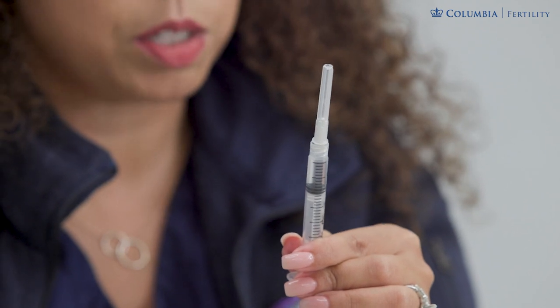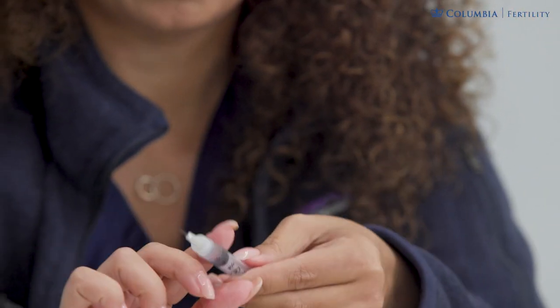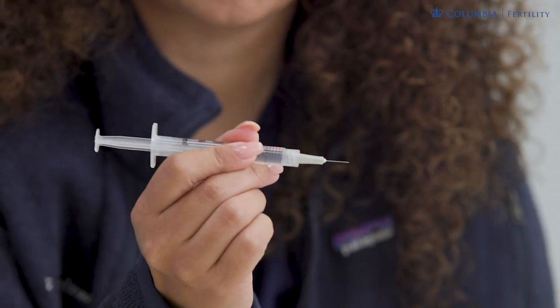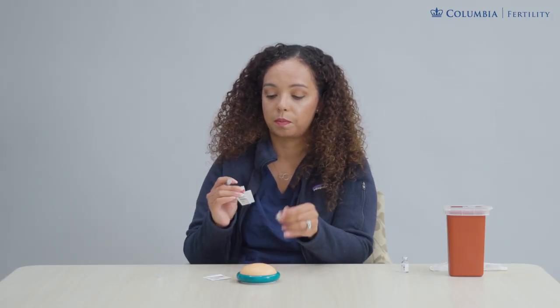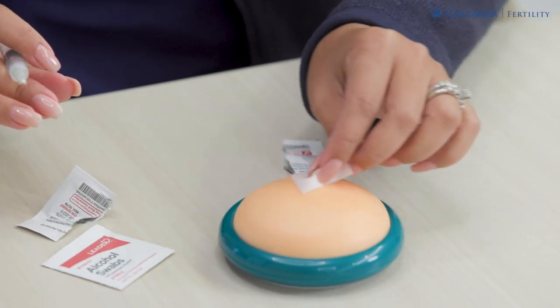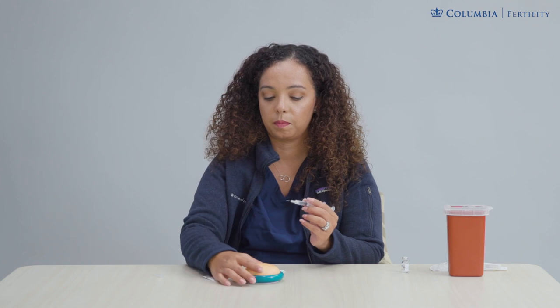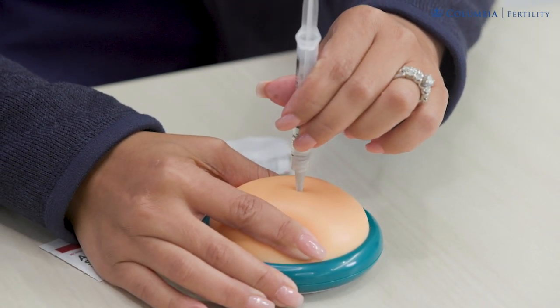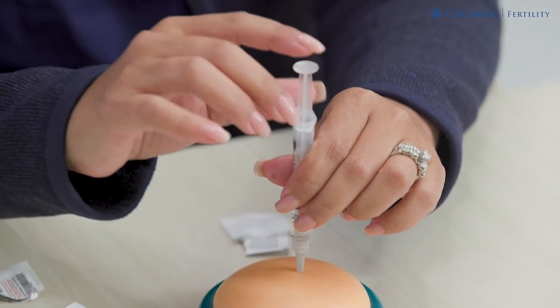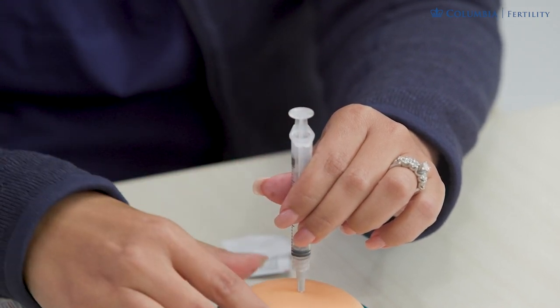Once you have completed those steps, you are ready to inject. First, remove the cap on the needle and hold your syringe like a pen. Do not touch the plunger until you are ready to push the medication inside. Clean the skin with alcohol, making sure the entire area is disinfected. Pinch the skin to create a bubble and inject right into that bubble at a 90 degree angle. Once the whole needle is under the skin, release the pinch and push down on the plunger to push all the medication inside. Remove your syringe and dispose of it immediately into your red container.